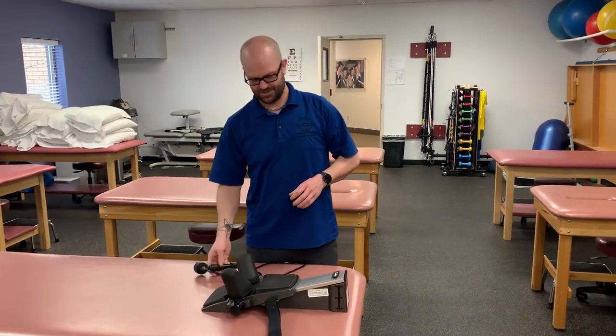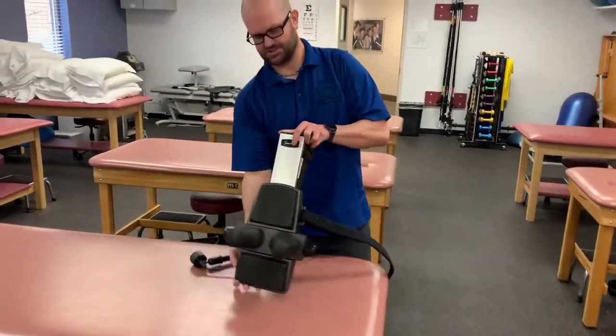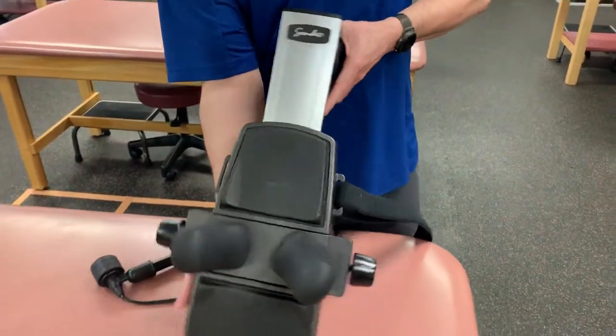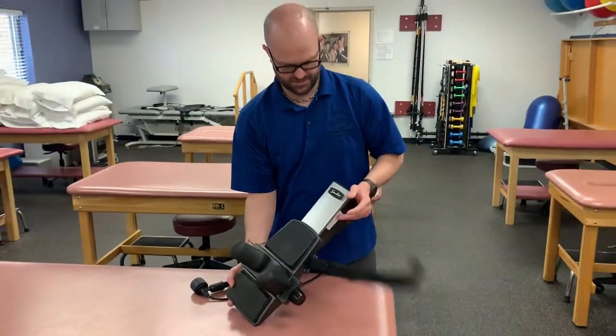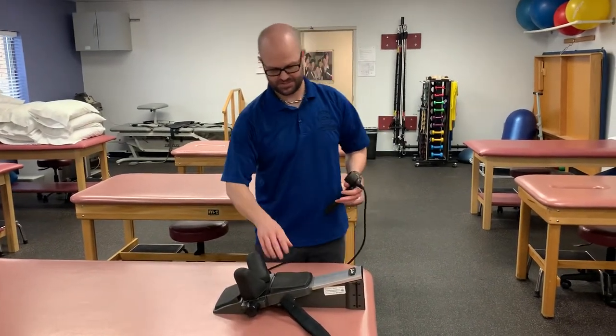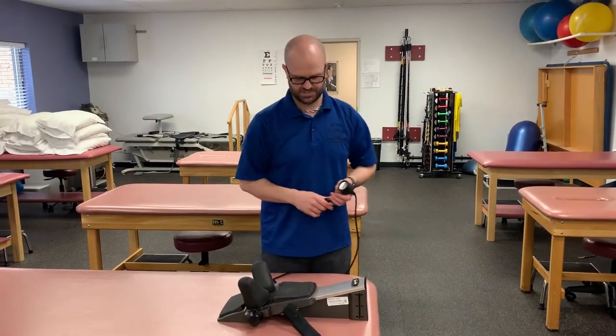Hello! Welcome back again. Now we're talking about cervical traction. Here we have a nice little cervical traction machine that we can utilize. It's pretty easy for the patient to run themselves as well if we feel that's appropriate — we trust the patient with it.